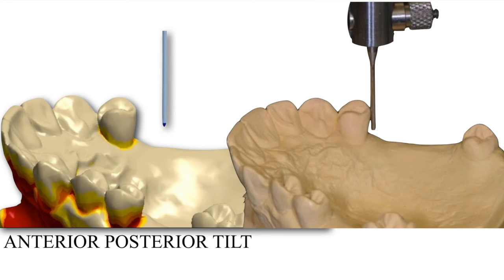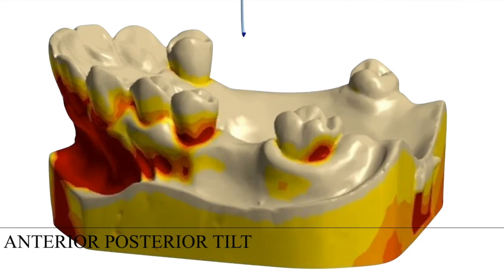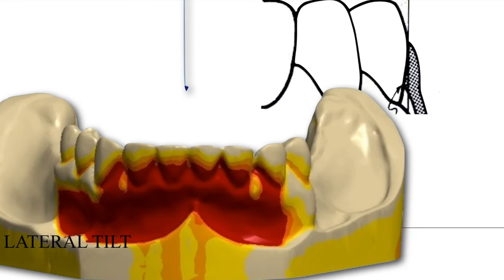So again, for the anterior posterior tilt, generally, whenever possible, make the occlusal plane parallel to the base of the surveyor. Once you complete the anterior posterior tilt, the next step is making the lateral tilt.